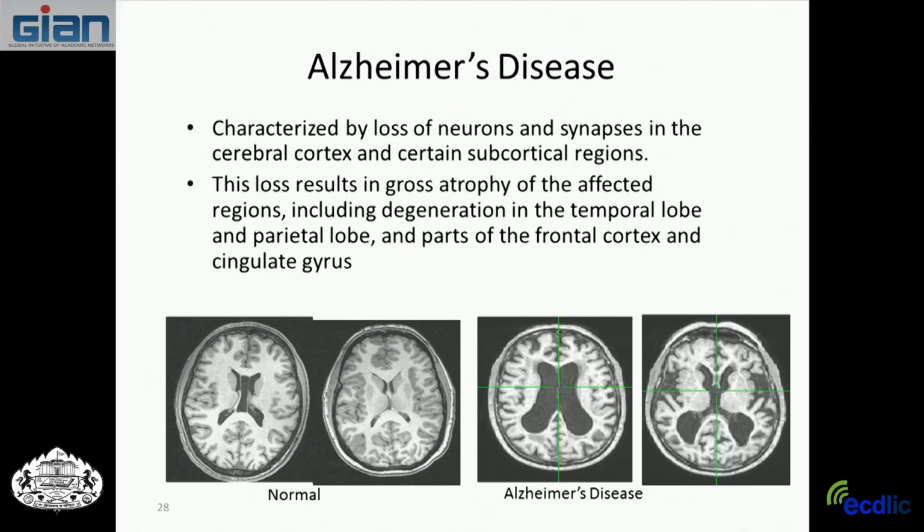So on the left here is the normal brain, and on the right here are 2 Alzheimer's brains. And you can see just how intensely the ventricles of this person's brain have enlarged over time. And another thing that you can notice here on the far right brain is the temporal lobes, those little areas here, have really decayed and atrophied over time. So the tissue is sort of dying away or receding over time, and it's really causing a lot of memory problems for this person because remember we said that some of the memory formation takes place in these temporal lobes.